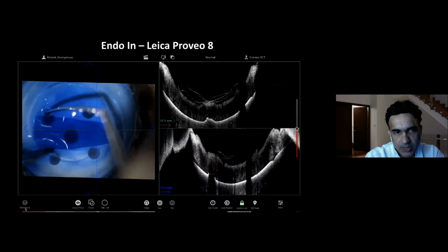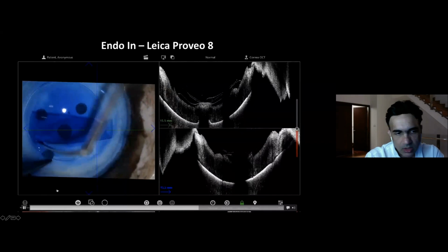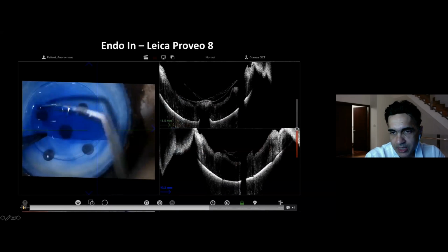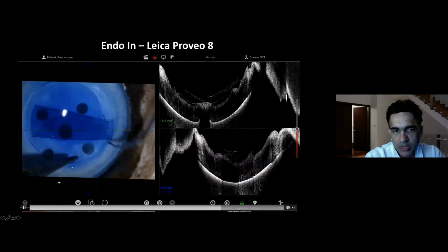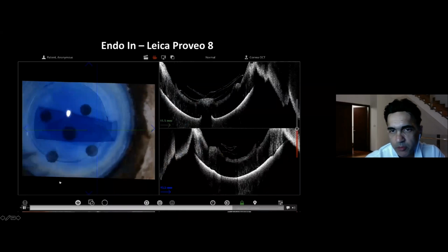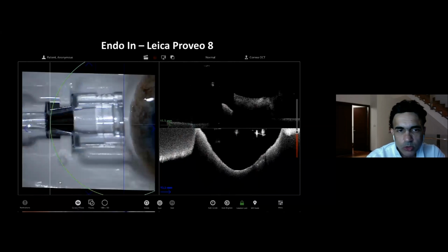I'm just making it a little bit neater, so you're ready to load this up into the graft device. You can see the trifold of the graft. And that gives you an idea of how much fluid to have there and how you can do this scroll without damaging the endothelium itself. And you're getting that feedback in real time from the OCT to give you some idea on how much fluid should be there when you're doing the scrolling.